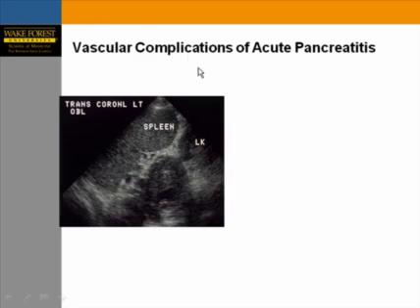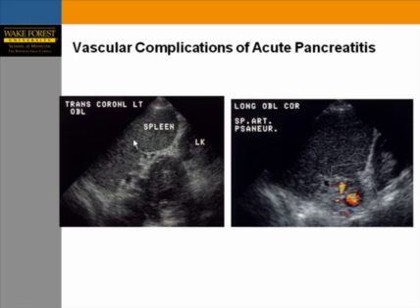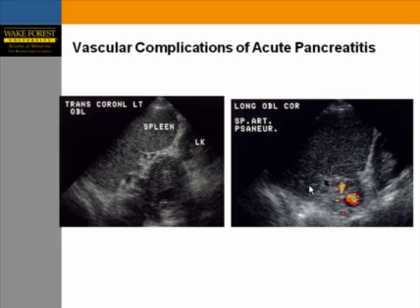Another complication of acute pancreatitis: the grayscale image appears normal, but color Doppler easily identifies this cystic structure as a pseudoaneurysm of the splenic artery.